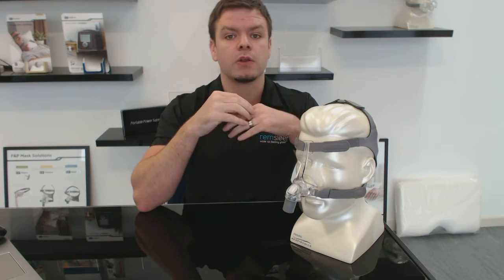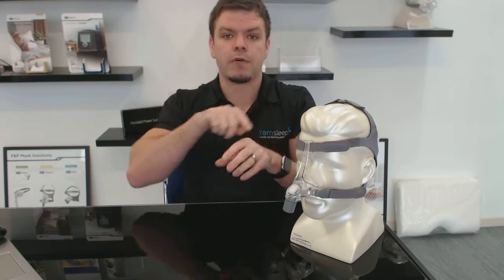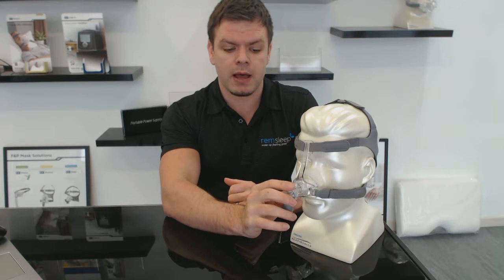All CPAP masks have exhalation ports — they're a must. But what they normally cause is a lot of noise, and the air flowing out through the holes can rebound and hit you in the face, and if you're sleeping with someone it can affect them too because the air shoots out across at them. Different companies have different ways of reducing this effect — some angle holes downwards, some have holes that go right around so the air disperses evenly — but I think this filter has got to be one of the best methods to reduce these effects.